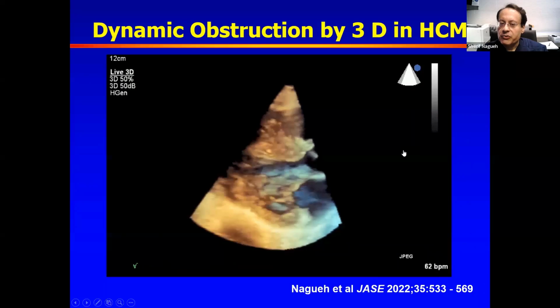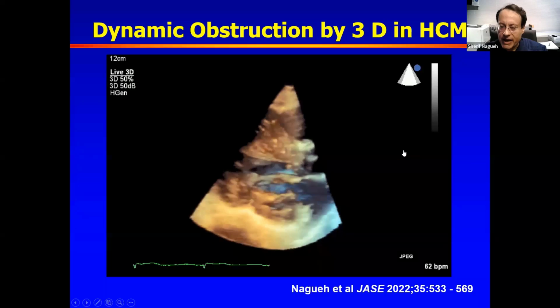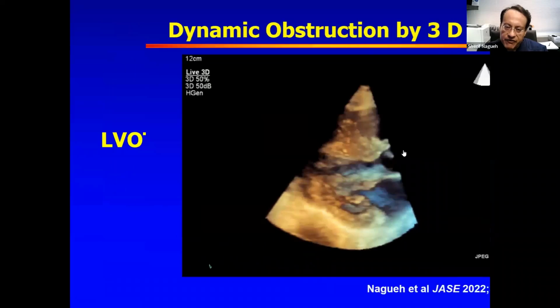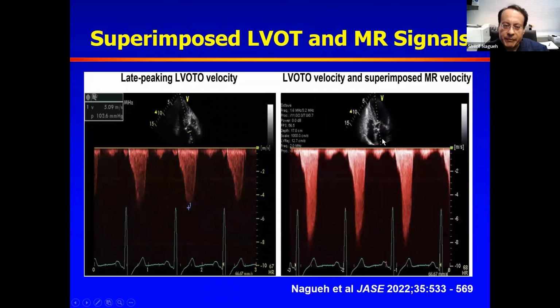3D is very useful as well, and that's a nice case showing you the apposition of the anterior leaflet with the septum. And again, if your lab is doing it routinely, you will gain more confidence and you'll be more comfortable with these acquisitions. And obviously the physicians will appreciate it a lot. As you can see, when the images are so clear, there are really no challenges in identification of pathology.